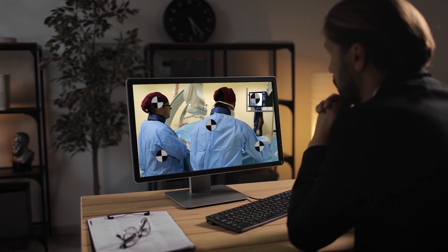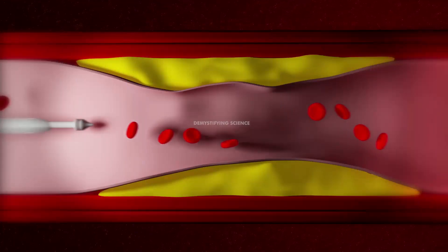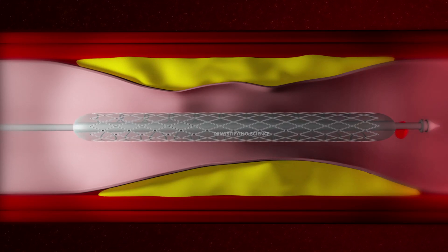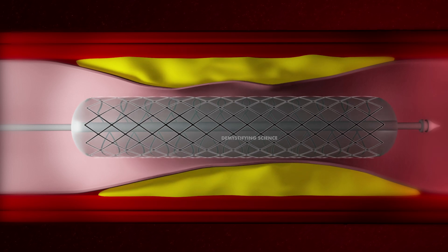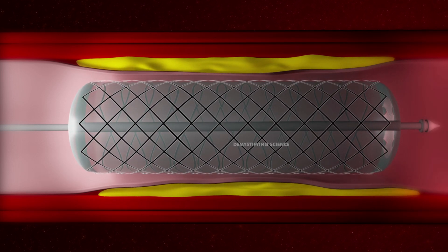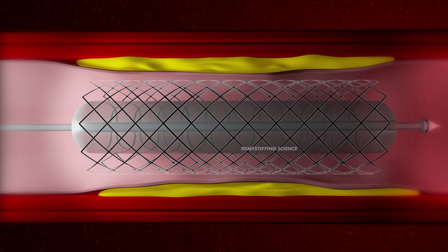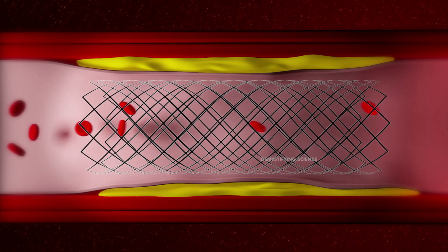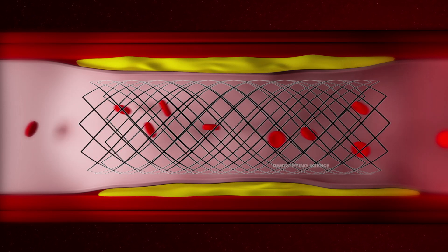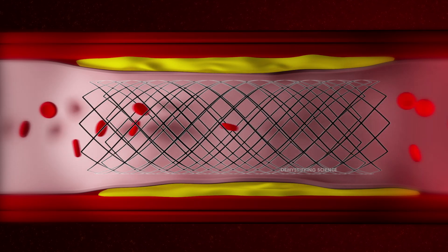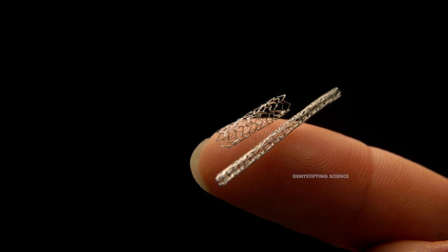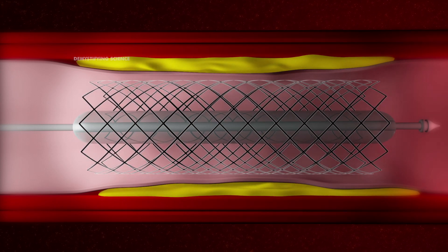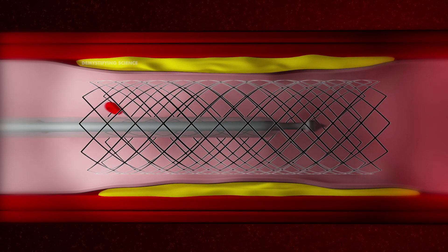Here is what happens during a stent placement. The stent, which is collapsed around a balloon at the tip of the catheter, is guided through the artery to the blockage. At the blockage, the balloon is inflated and the spring-like stent expands and locks into place inside the artery. The stent stays in the artery permanently to hold it open and improve blood flow to your heart. In some cases, more than one stent may be needed to open a blockage. Once the stent is in place, the balloon catheter is deflated and removed.